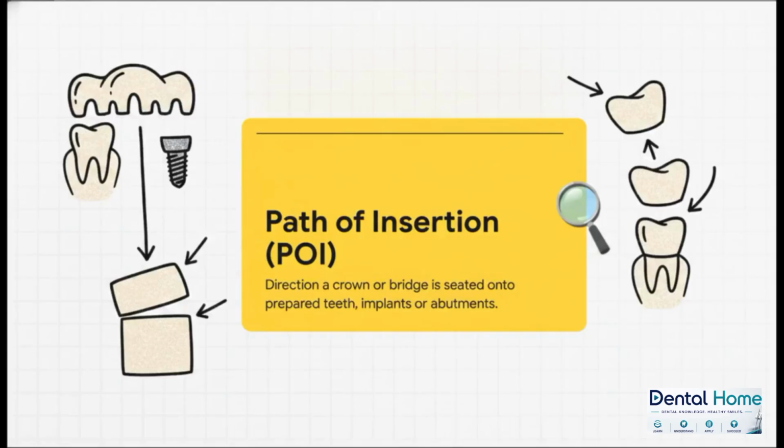It gets completely stuck. In dentistry, especially when we're dealing with a bridge that spans across multiple teeth or implants, all of those abutments and teeth must share a single, perfectly aligned common path. Actually, scratch that. It's not just a common path. It's an absolutely non-negotiable shared trajectory for easy, accurate seating.